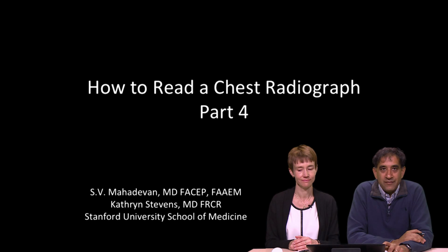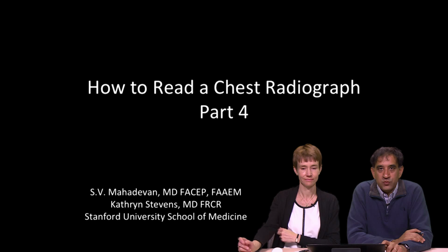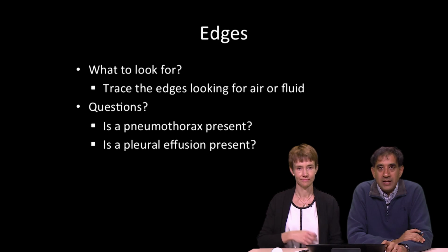Hi, this is Dr. Mahadevan with Dr. Stevens, and we're here to present How to Read a Chest Radiograph Part 4. On the last lecture, we finished with diaphragm, and now we're at E, or edges.